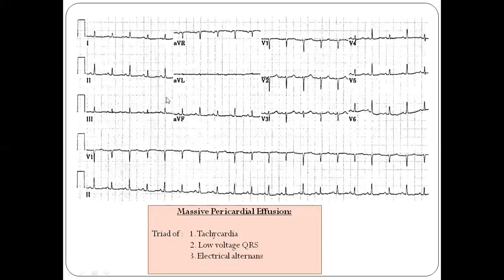Here you can see an example ECG showing low voltages. As stated, the QRS should be less than 5mm in limb leads — one large square equals five millimeters of height. You can see the QRS complex is only about three to four small squares, meaning three to four millimeters in the limb leads, confirming low voltage. In the chest leads, it should normally be more than 10mm, but here the R wave to S measures approximately eight millimeters — again confirming low voltage ECG.